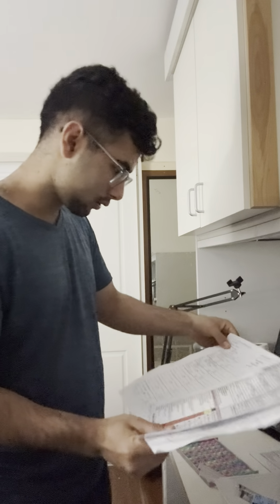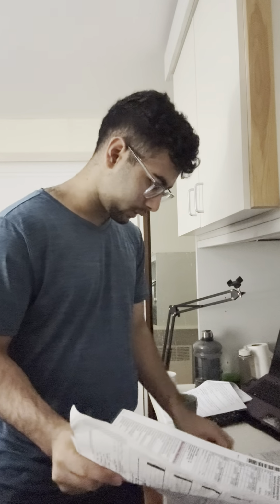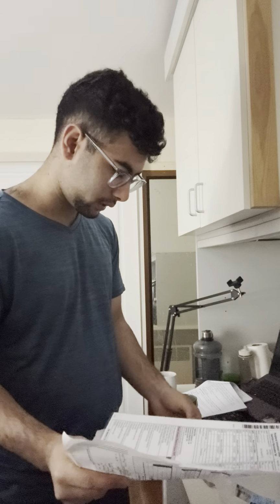Hi. So we're going to check this. We've got the VIP check. We've got the medication order right here, right? We're going to check it. So right patient, right order. Okay, right order. Okay, how much are we giving? Okay, 10 ml we are giving. Okay, it's written here. Now we're going to assess the VIP, assess the cannula. So the cannula looks fine.